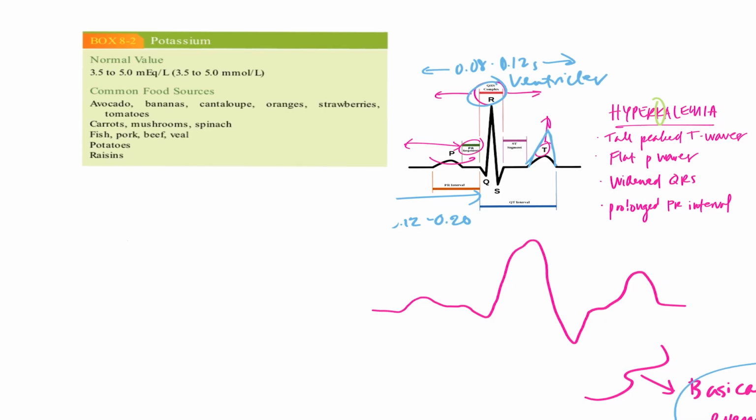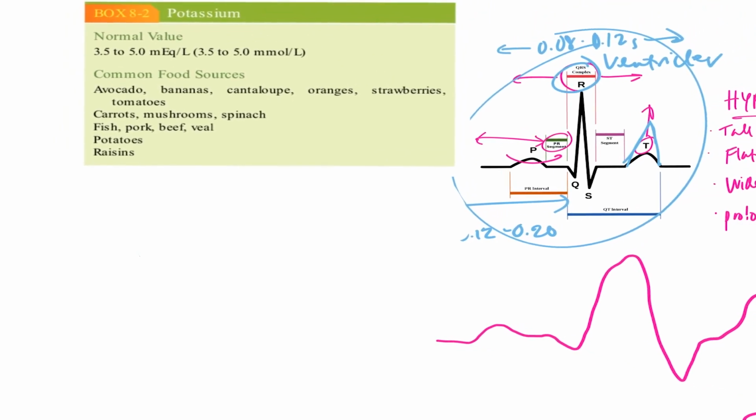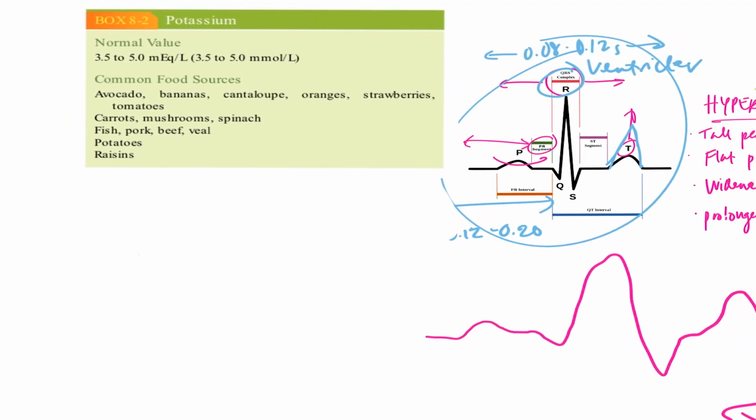So this is a problem. You can see how it's affecting so much of the EKG wave. And so your patient is not in good health if he or she is hyperkalemic. So what are you going to do?